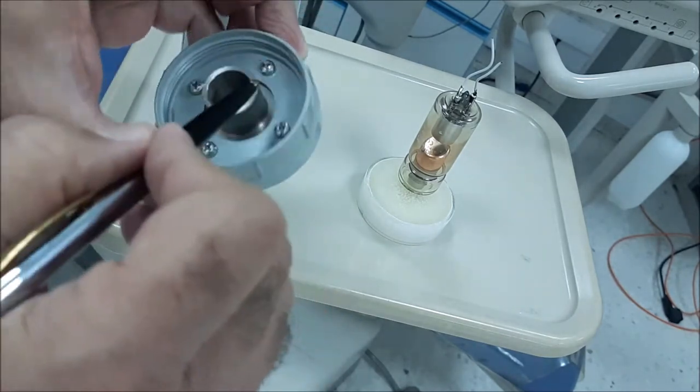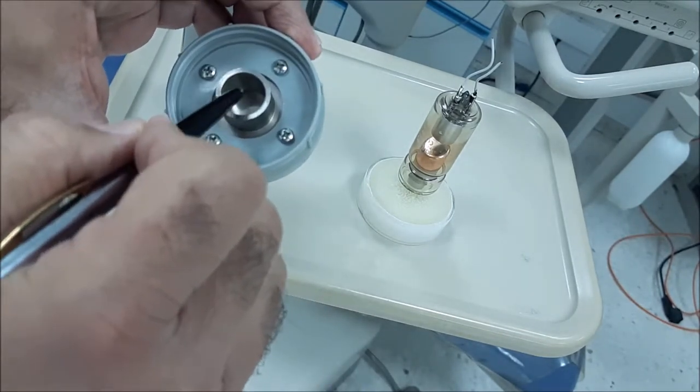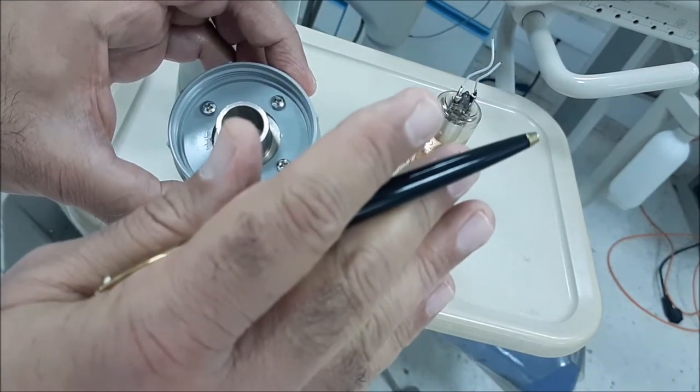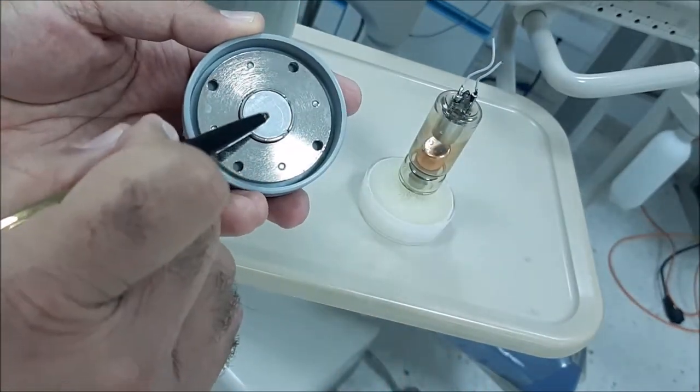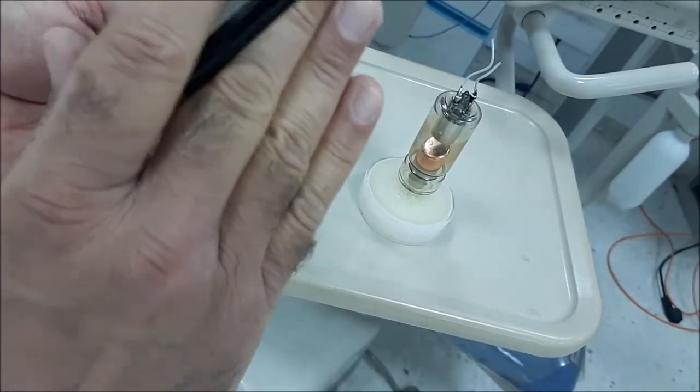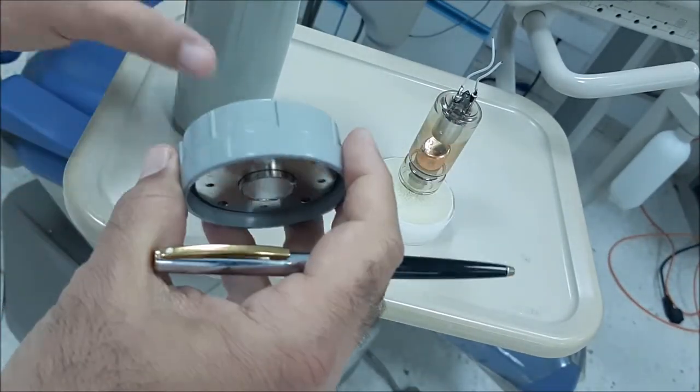It's made of lead because lead has the ability to absorb all types, all energies of x-ray, while the aluminum filter is made of aluminum because it only cuts off the low energy x-ray.